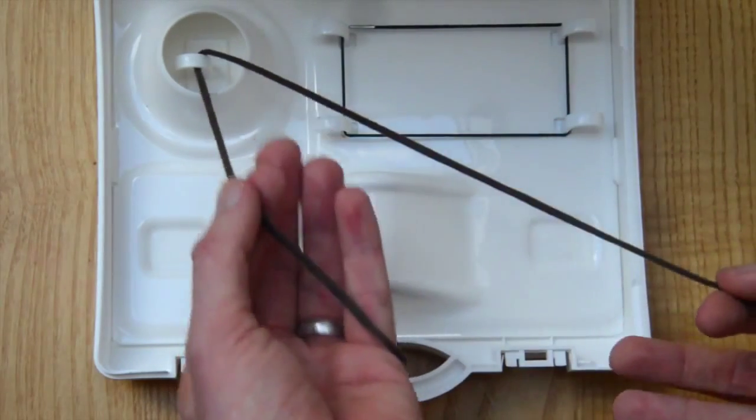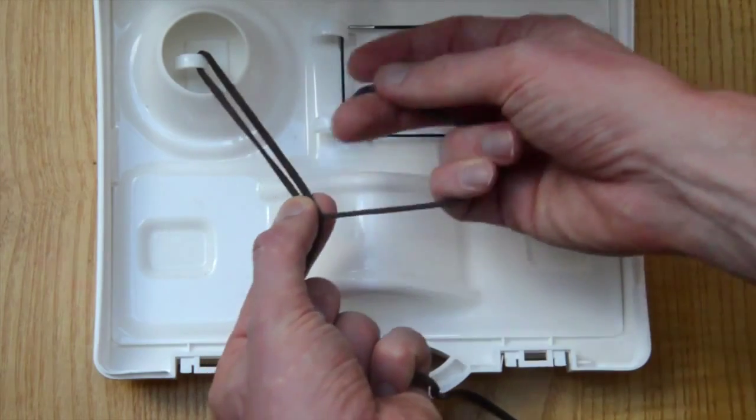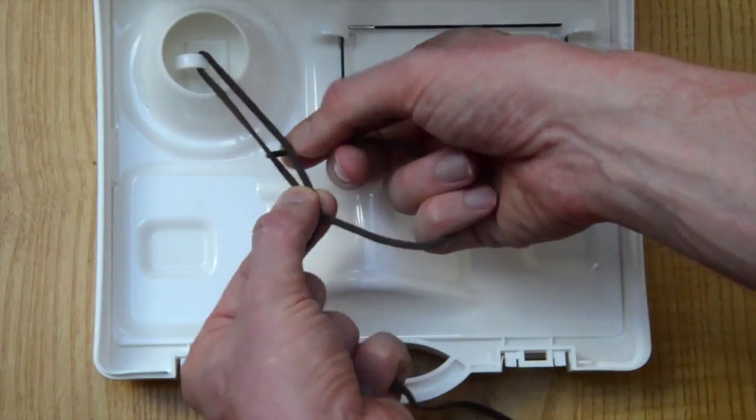Keep the left hand thread short and the right hand thread long. Pass the left hand thread round and throw one single hitch as shown here.